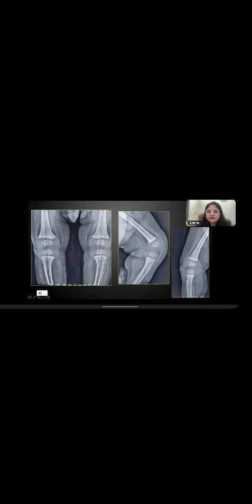Osteomyelitis can be a DD. For a lot of malignant lesions, you can have a DD of osteomyelitis. So keep it lower on your differentials. See, whenever you are reporting X-rays, do not close your channel of reporting. Always try and keep your options open and say that it is likely my differentials are 1, 2, 3. However, in such cases, I would like to entertain only differential number 1 and 2. That is how you should answer.